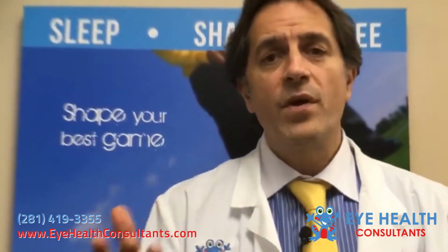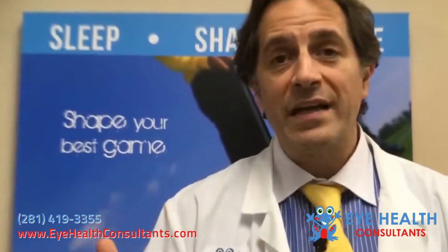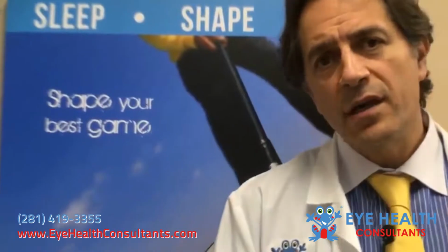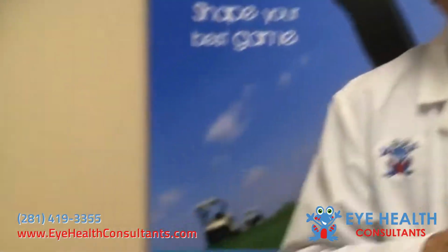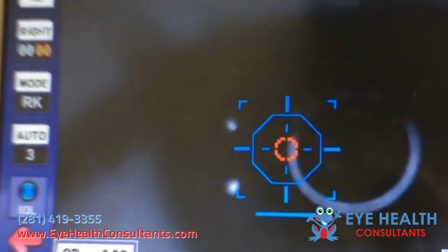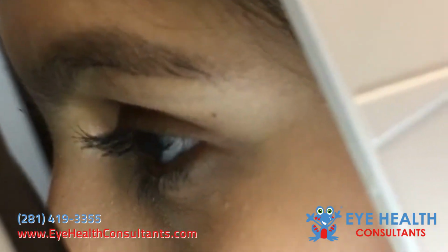Refractive status means whether you are nearsighted, whether you are farsighted, you need glasses for near, for distance, etc. And for that, we use this technology called autorefractor, which is a computer that measures the refractive status. It tells us pretty accurately many times whether the patient needs glasses or not, and if they need glasses, whether they are farsighted or nearsighted or astigmatic or whatever else they are.